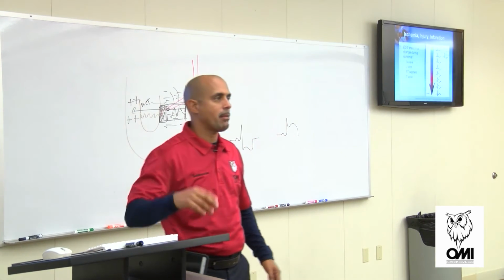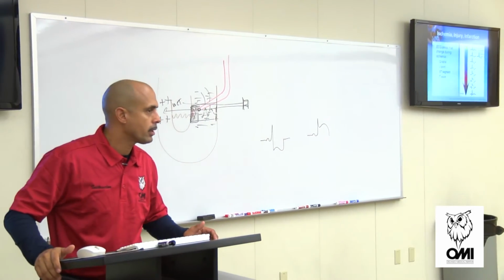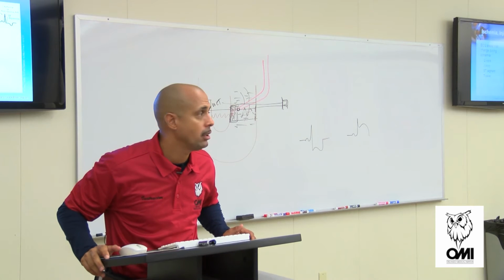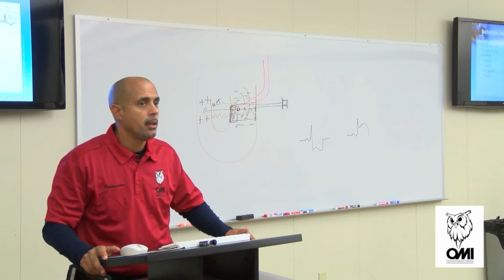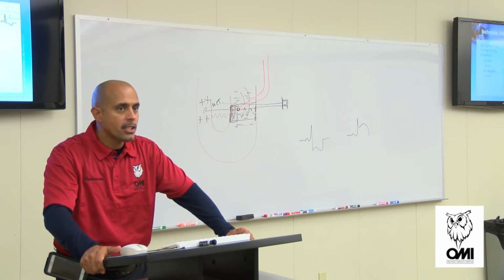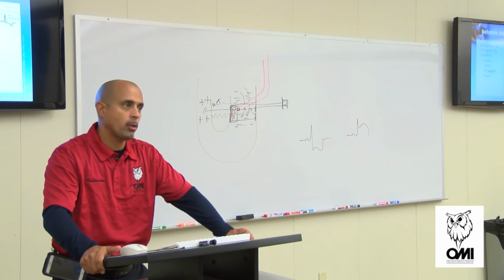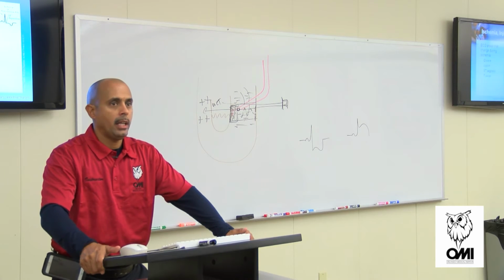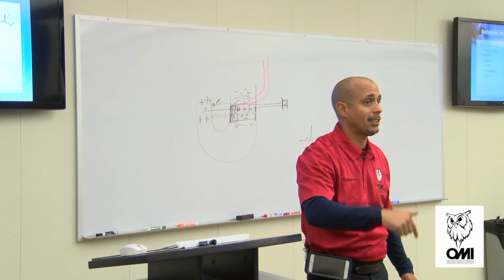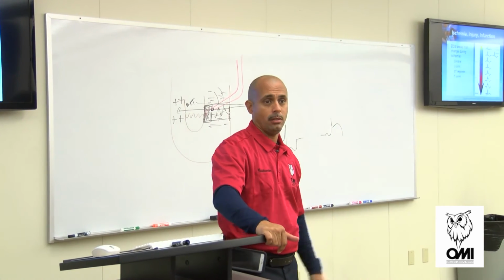Because syncopal episodes are common in 12 lead. You know what syncopal episodes are common in? Women, diabetics. And you know who else is a critical patient? We're going to talk about it a little bit. But a patient who syncopized, and I did a 12 lead, and he has Brugada syndrome, that dude has 1 foot in the grave, and he's slipping on a banana peel. And if you don't recognize that Brugada, and he's syncopized, that's a guy that I got to go to a chest pain center. When? Scotty beamed me up 2 minutes ago.